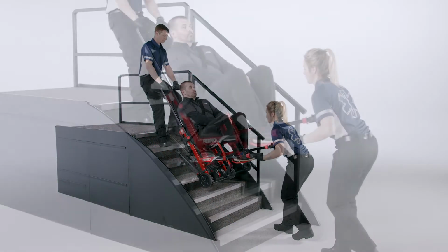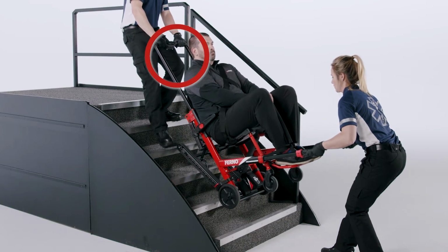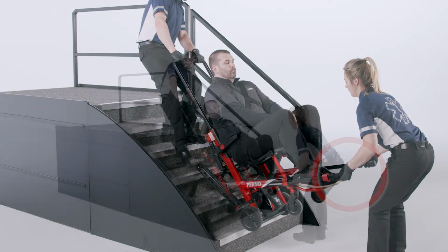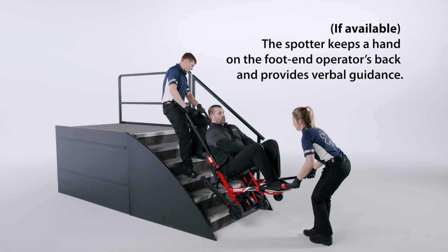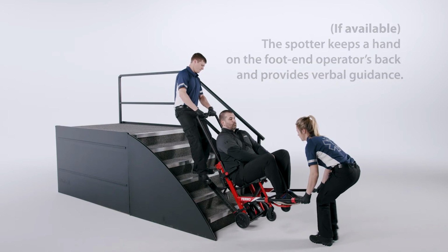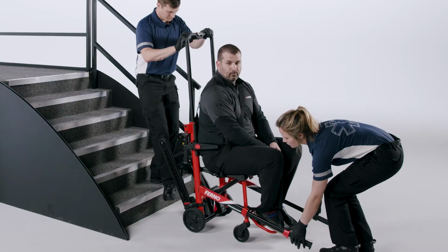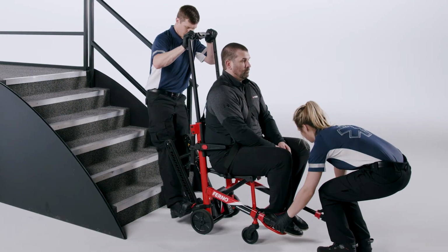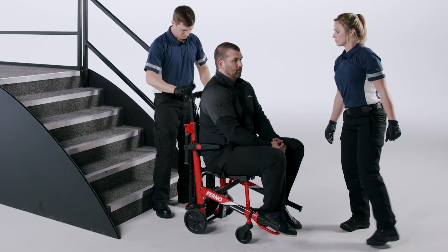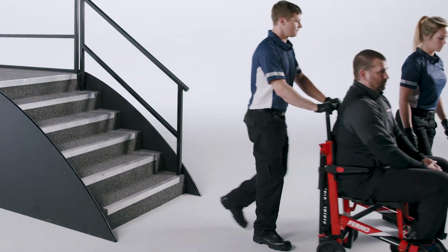And to maintain the glide angle, apply slight downward pressure on the lift bar and slight upward pressure on the foot end lift handles. The spotter, if available, keeps a hand on the foot end operator's back and provides verbal guidance. At the bottom of the stairs, tilt the chair onto all 4 wheels as the operator stops pressing the descend button. Retract the lift handles, adjust the lift bar, and close the track system.